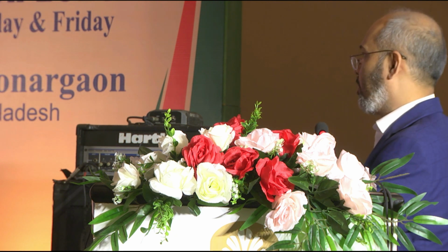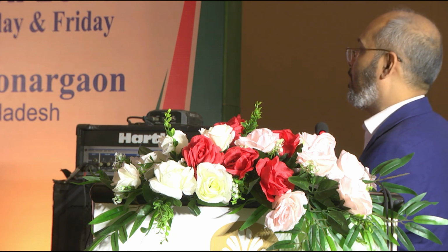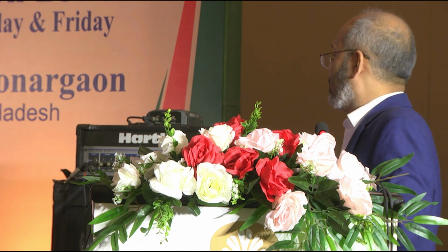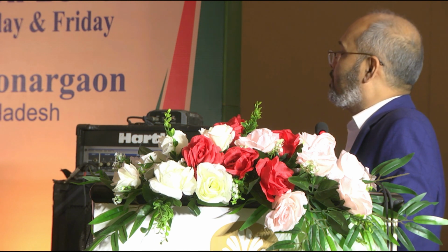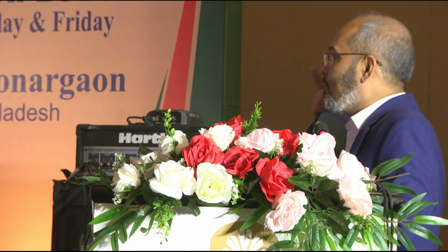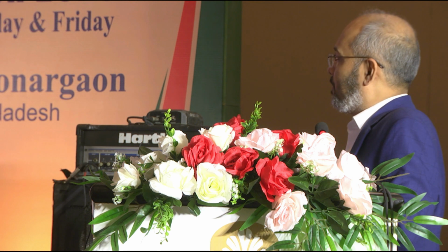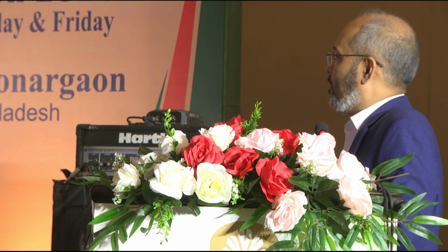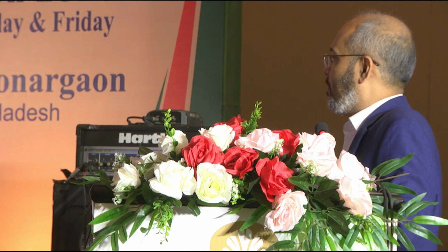Good afternoon, and it's very nice to see you do a case, and we are super excited to see how it proceeds. So we've got a patient who has essentially multivessel disease, and the lesions tend to be very tight, and there's some degree of slow flow as well, pretty complex anatomy, and I see that you've already wired the circ.